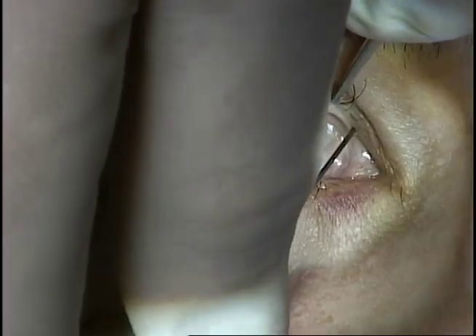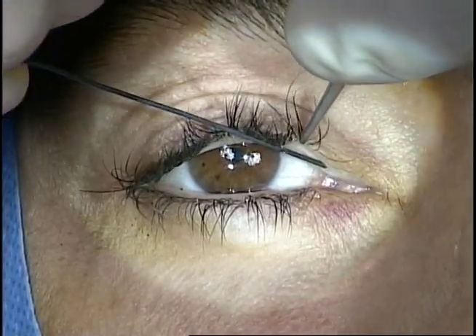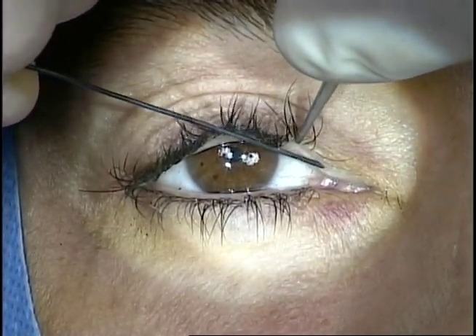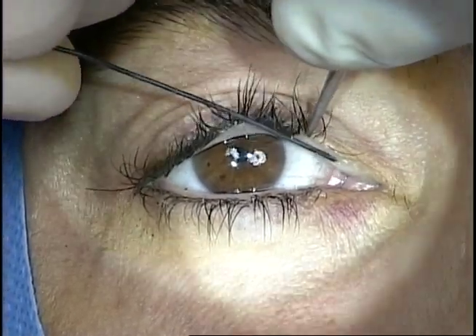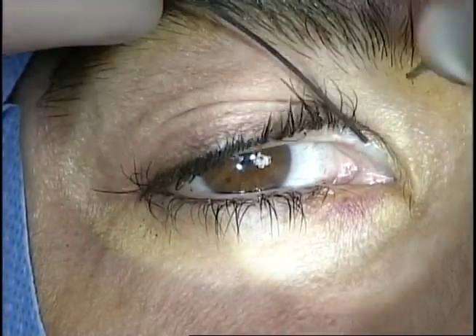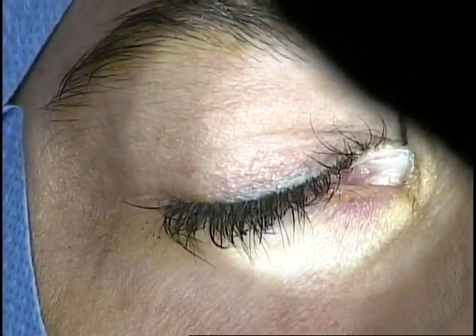The same is performed on the upper lid. Again, the Bowman probe is first introduced vertically, followed by a horizontal advancement through the canaliculus where a hard stop is appreciated.